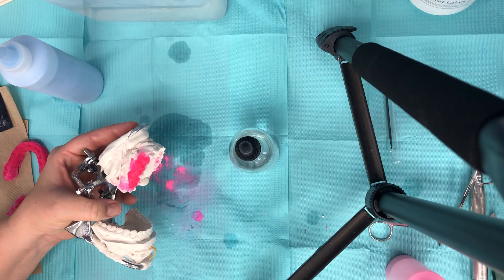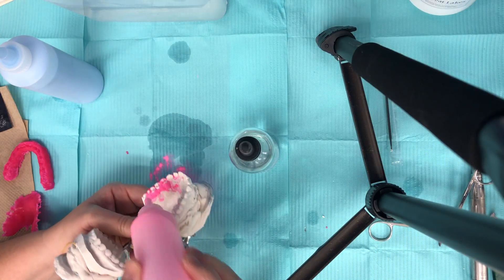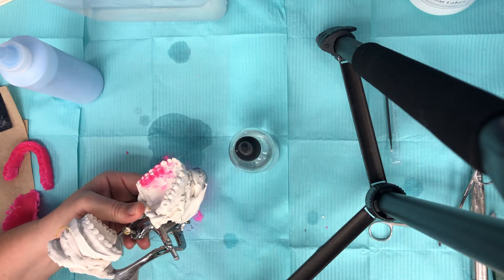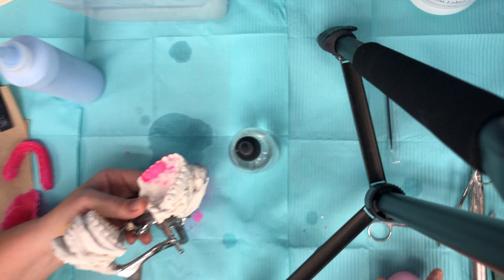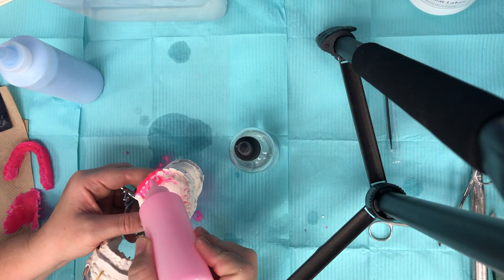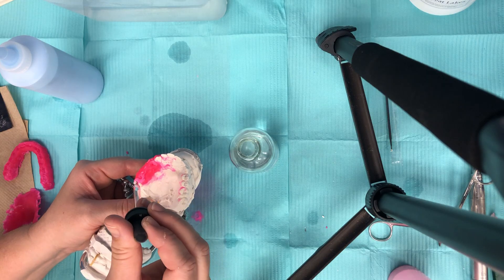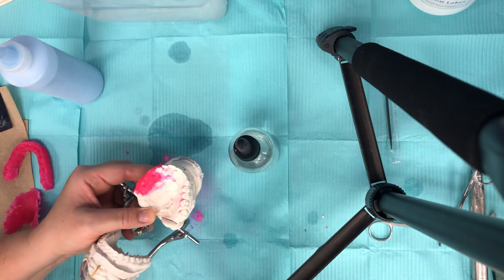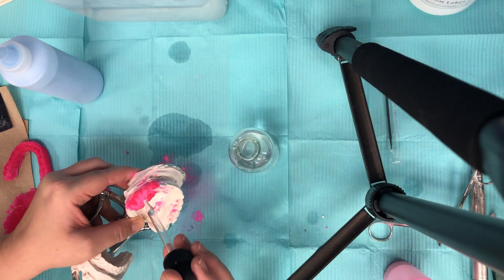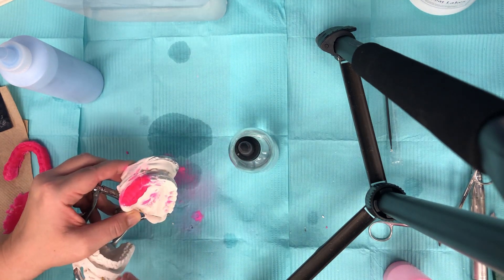Once we're done working on one side I will go to the lingual and then the occlusal surface — the biting surface. One of the techniques I'll show you is when we get some rope wax, I'll line it around so it kind of acts like a shelf so we lose even less polymer.